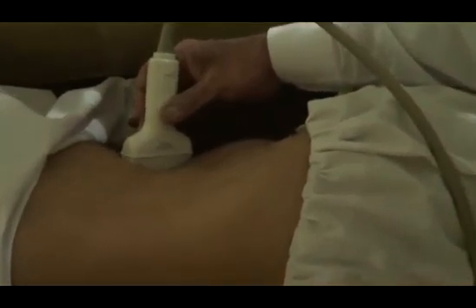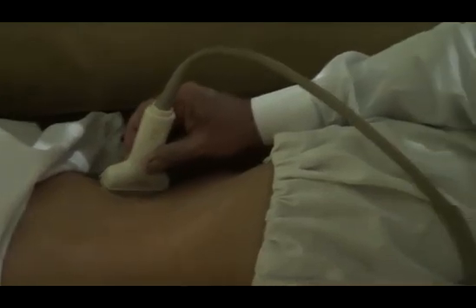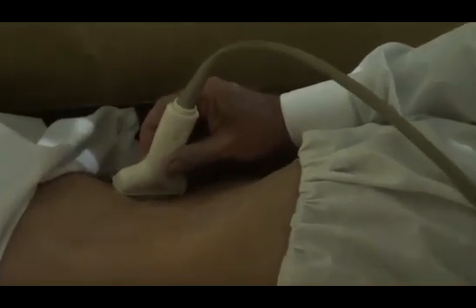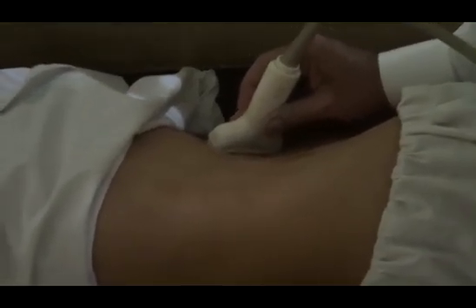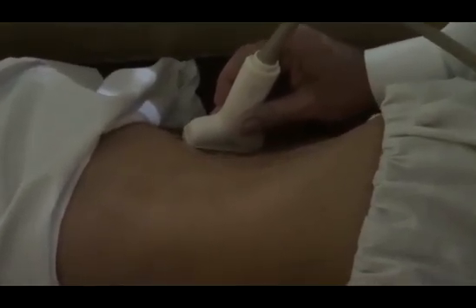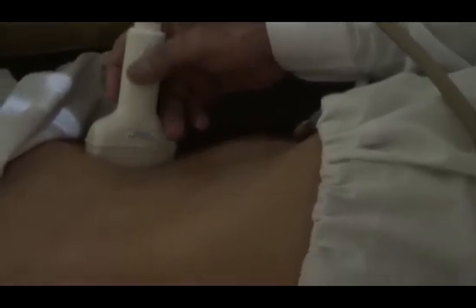Ask the patient to turn to the left lateral decubitus posture. Place the probe below the subcostal region, angle it in the same way, and you will get the gallbladder in its full length. If not, you can ask the patient to take a deep breath and hold it.